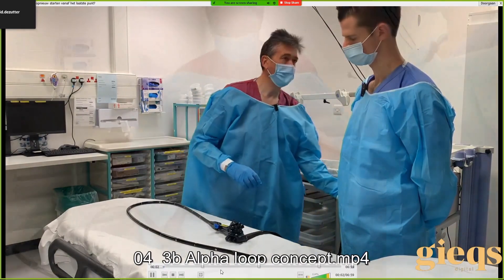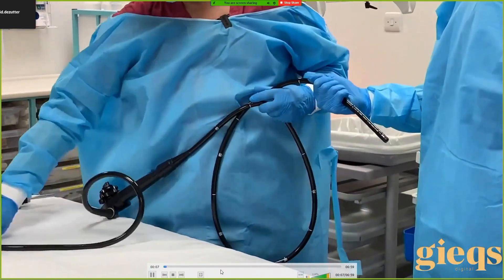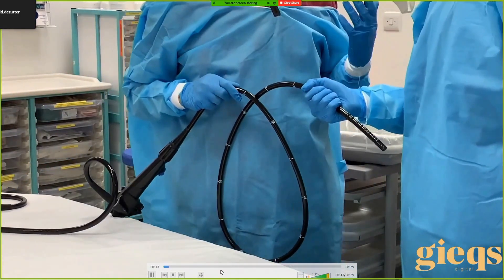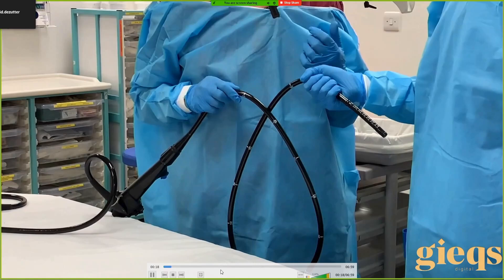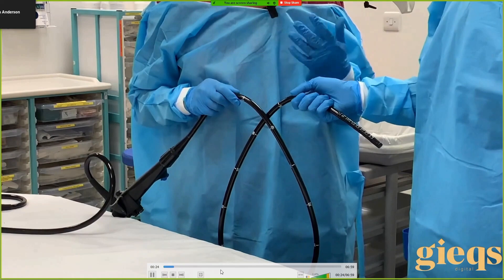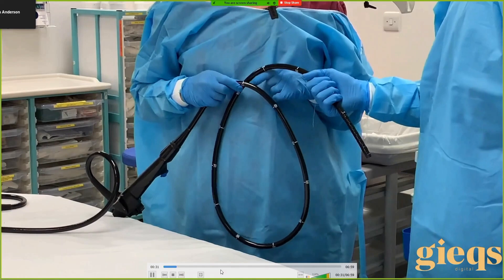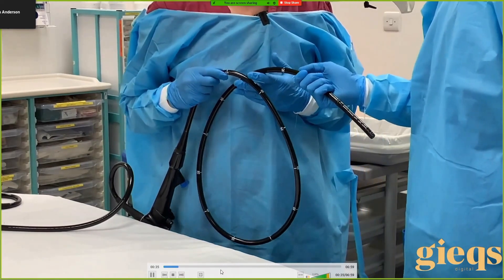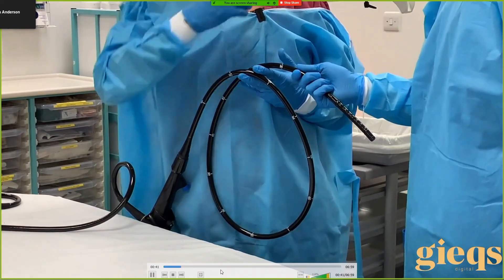Now let's assume you have formed a loop. In terms of loop resolution there are really only two major actions you can do. The first one we've just covered — pulling out. The other one is untwisting the loop, applying torque, which effectively resolves the loop. So you've pushed the loop in, you're not going forward, the patient's uncomfortable — you can either pull back, or apply torque, or do them both together.